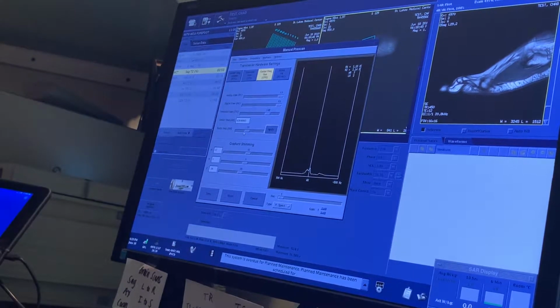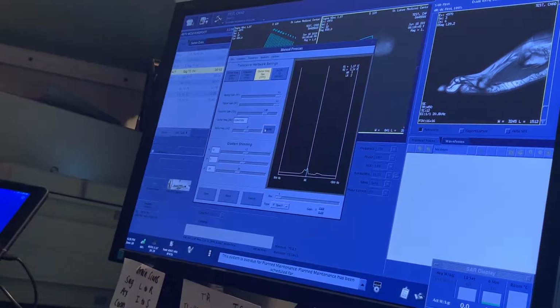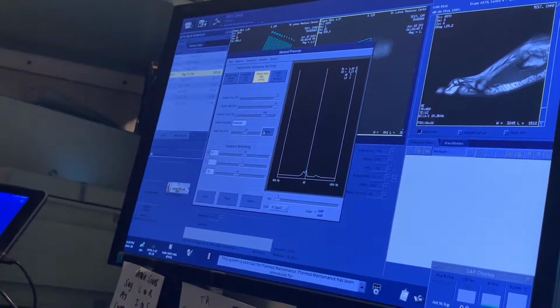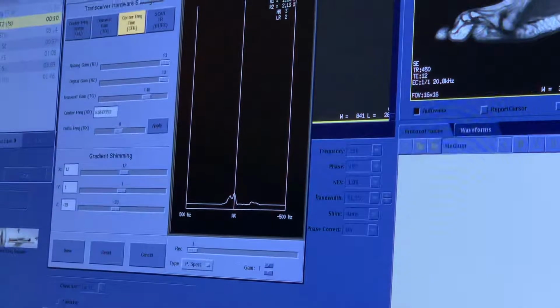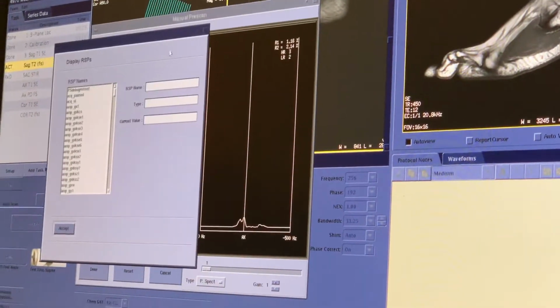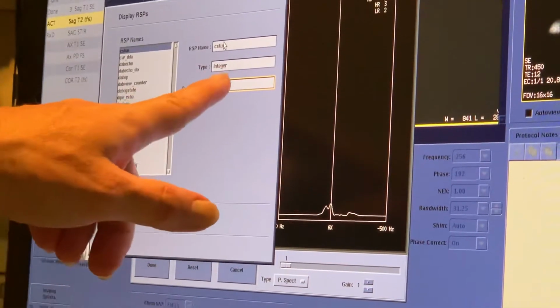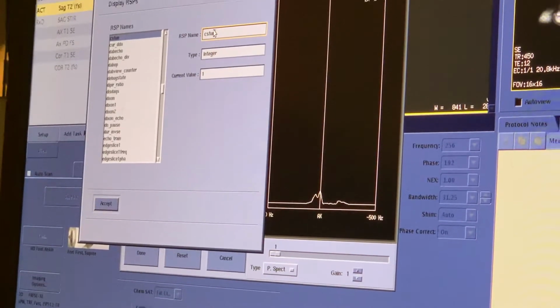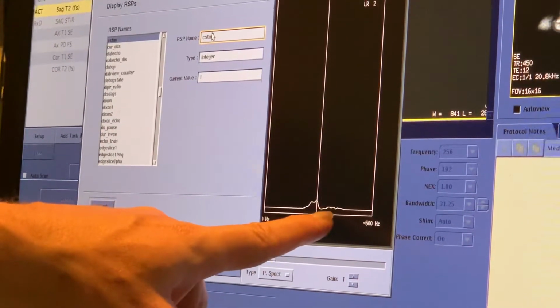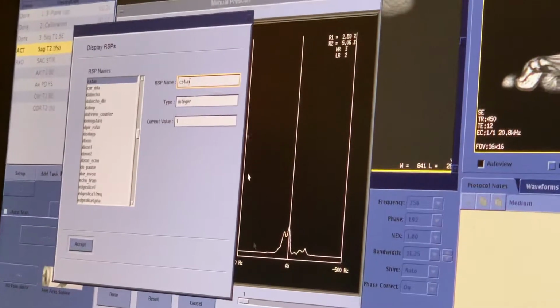I'm not quite there. So let's go another 8. Yeah, all right. So you see how that moved over, and now I'm exactly right on that peak. But I'm going to want to get rid of as much of this fat peak as I can. So I go to modify options, modify RSP, and the RSP, you have to take the caps lock off, and it's CSTUN. And then it's going to integer, and it's going to give you a value of 0. You want 1. And then if you hit enter, that should drop that down a little bit more. You see how that just hit that? And all of a sudden it came back. Darn it, but that's the best you can do.